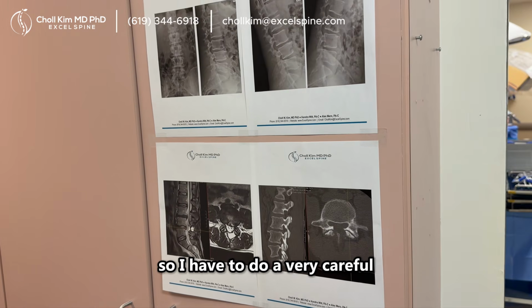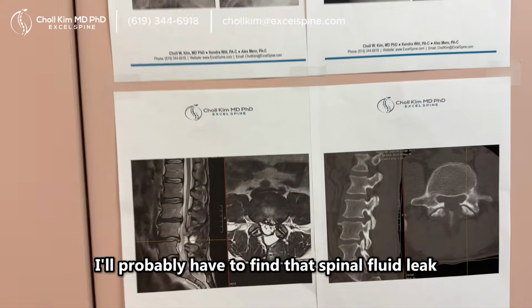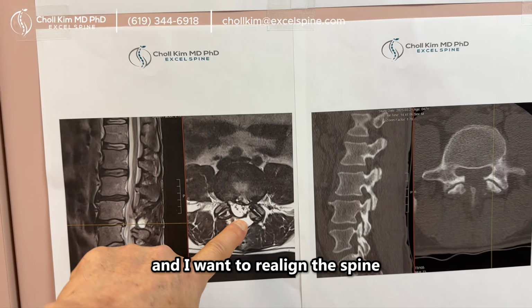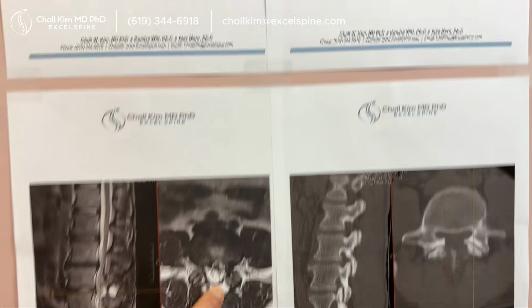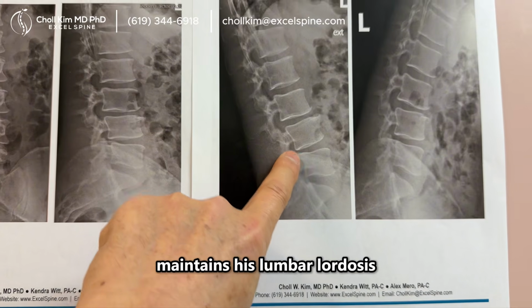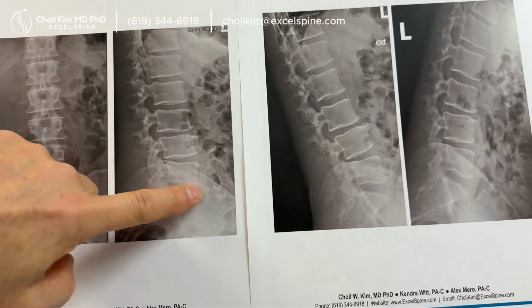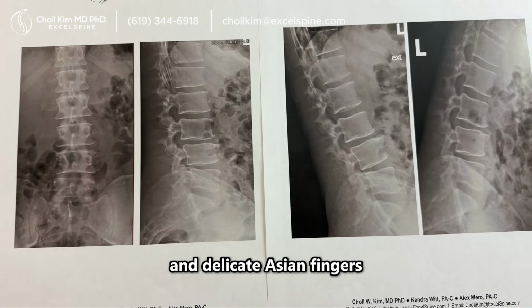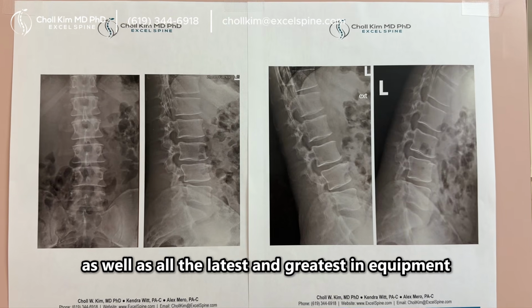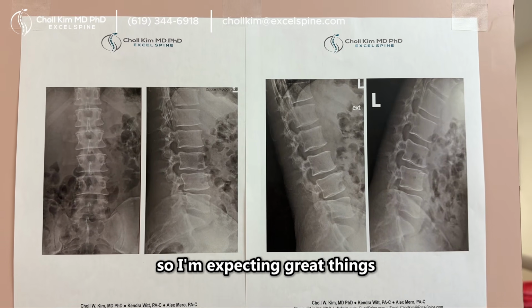So I have to do a very careful, meticulous job because I'll probably have to find that spinal fluid leak and repair it if it's still leaking. And I want to realign the spine in a way that opens up the space for the nerves, maintains his lumbar lordosis, because you can see how flat his spine is, all through 2 little incisions and delicate Asian fingers, as well as all the latest and greatest in equipment and computer-assisted navigation. So I'm expecting great things.